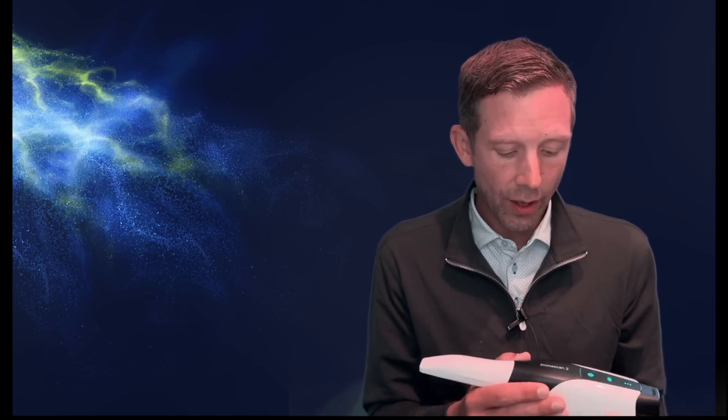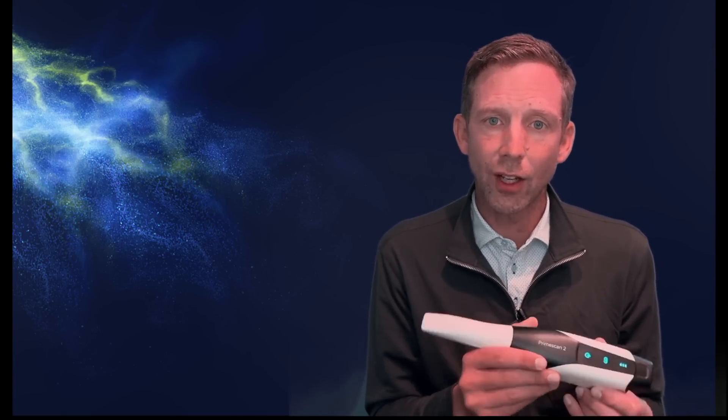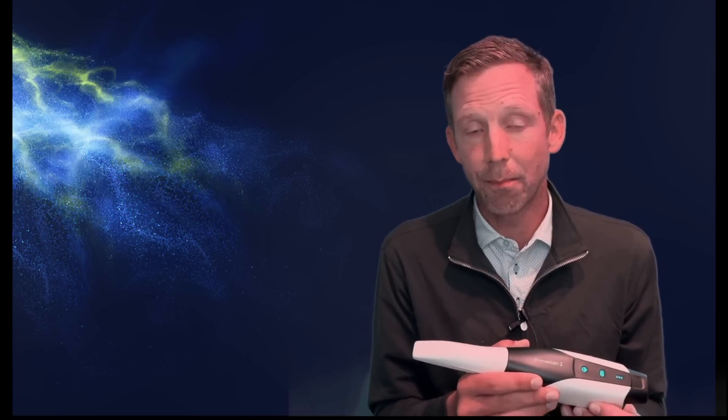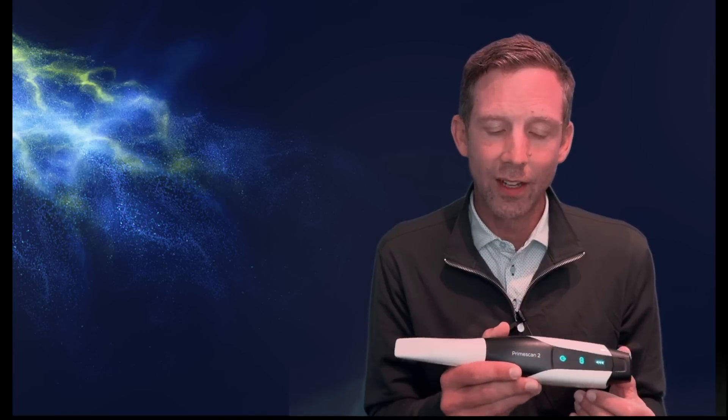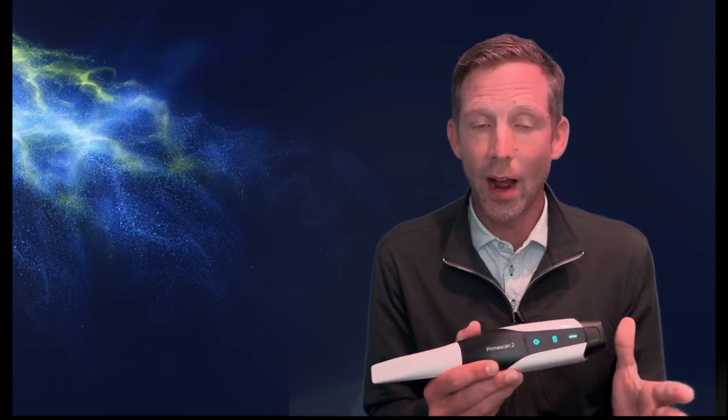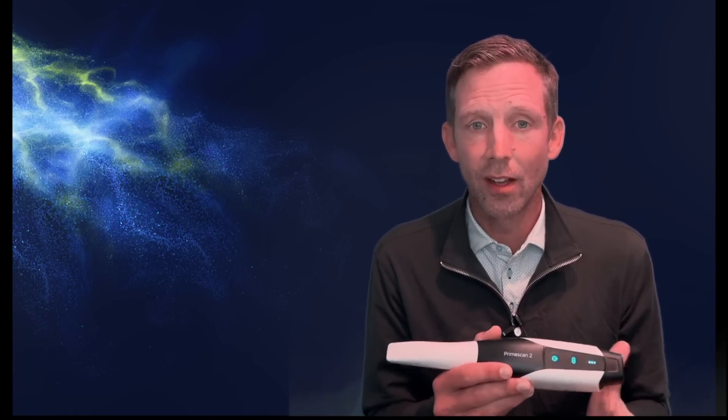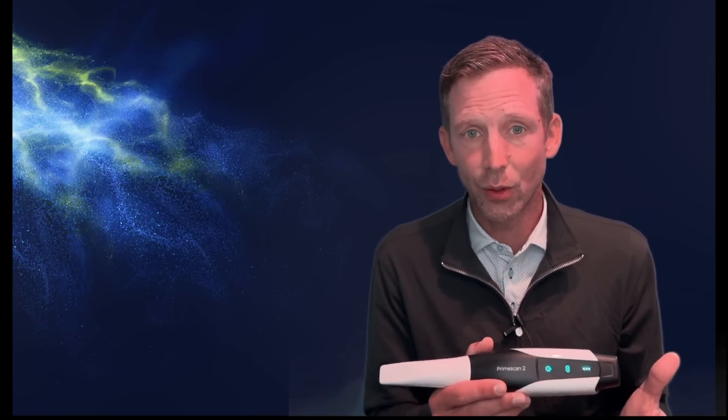So like I said in this video, I just want to go through exactly how this may work. So let me start by just scanning a model, just to show you how this works within DS Core.